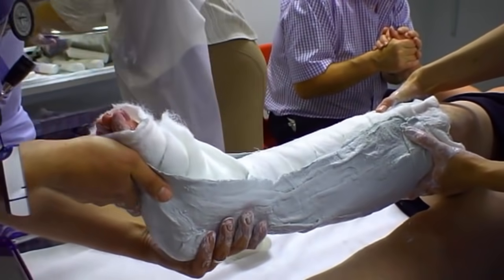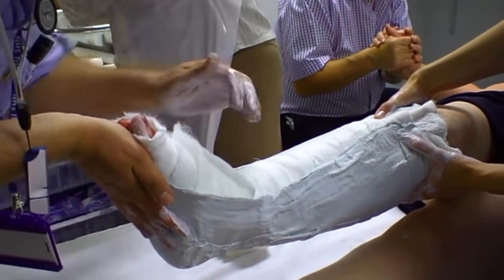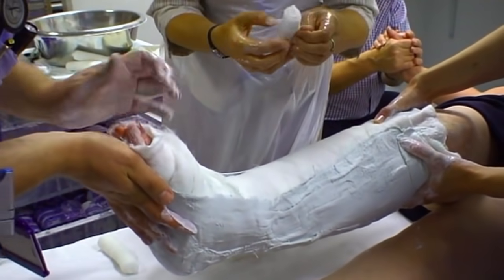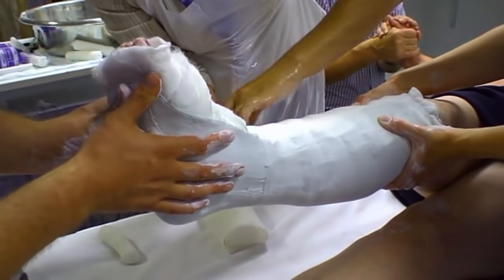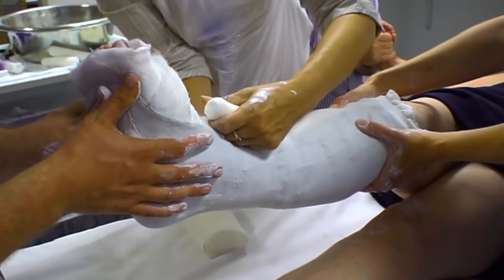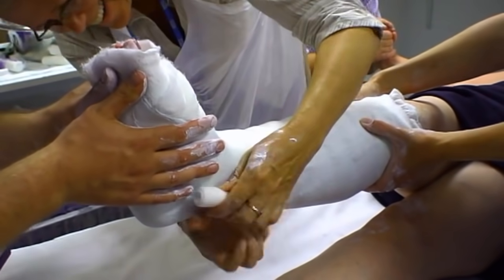It's very important now to mold the plaster to the shape of the lower leg and foot to try and hold the foot in the anatomical position.